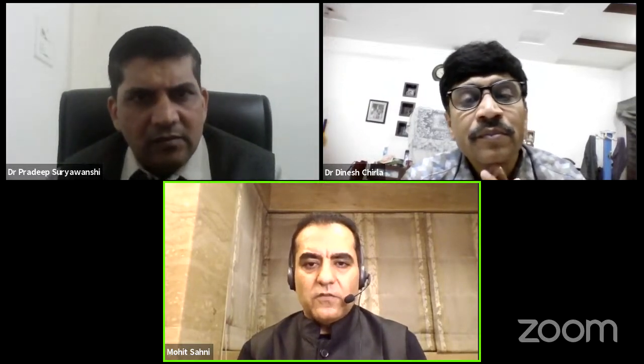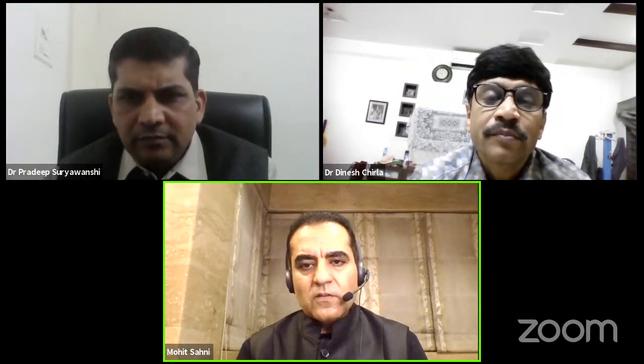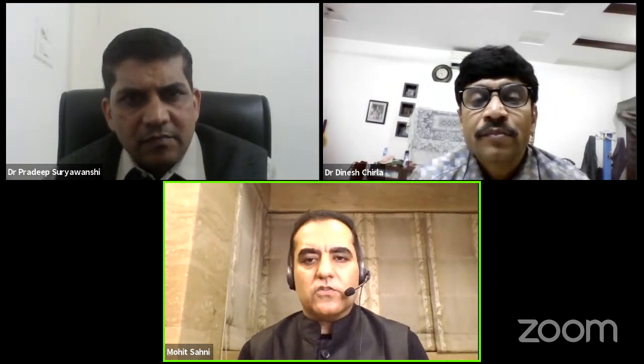So this is something which is very genuinely asked. In that case, if you have increased intrathoracic pressure, the best window to get the views is subcostal. Because the subcostal window is a window in which you will get all the views: apical 4 chamber, 5 chamber, parasternal long axis, short axis, everything from subcostal views. So the best way to get the views is through the subcostal window.